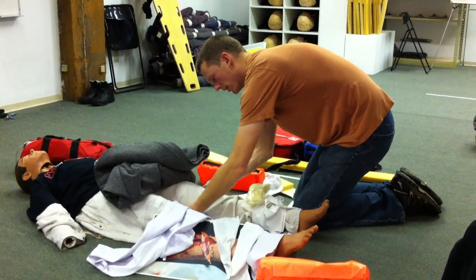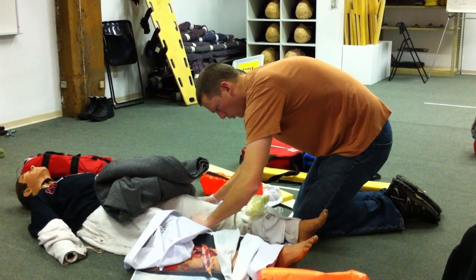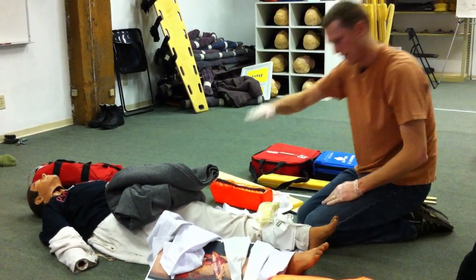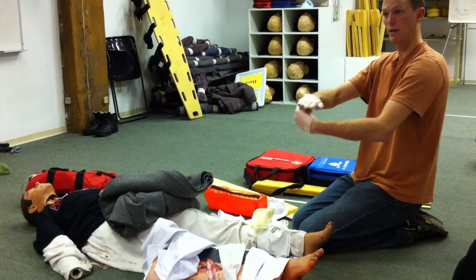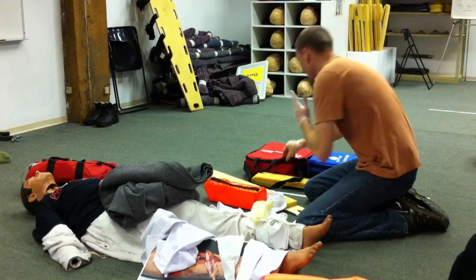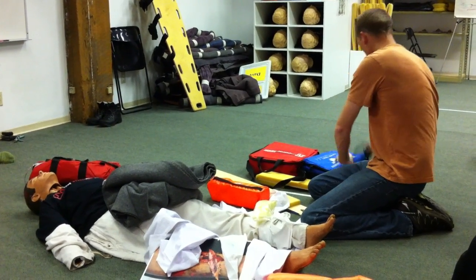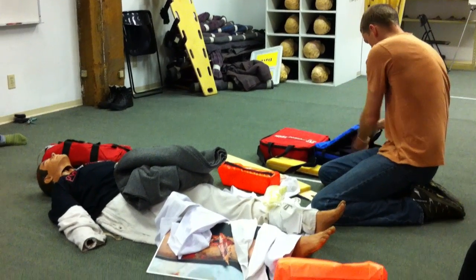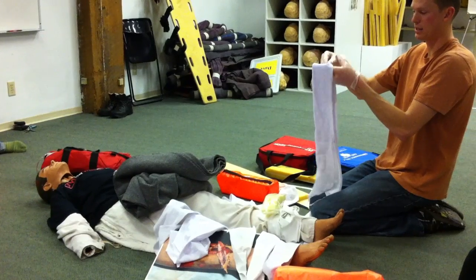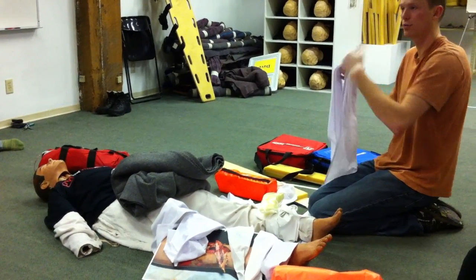General rule to go with is when you're putting your ties in, when you put your triangulars in, you don't want to be able to touch anywhere once they're tied, like this, and not hit two triangular bandages. That's kind of a good goal to go with. There is a minimum number of triangulars that we want, but if you've got a short leg, it may not be as necessary to have as many, or you've got my leg, and you're going to have to use three people's kits.